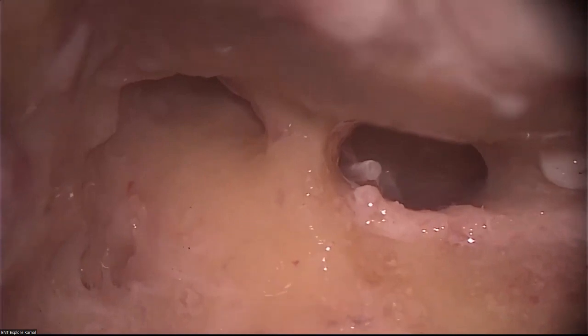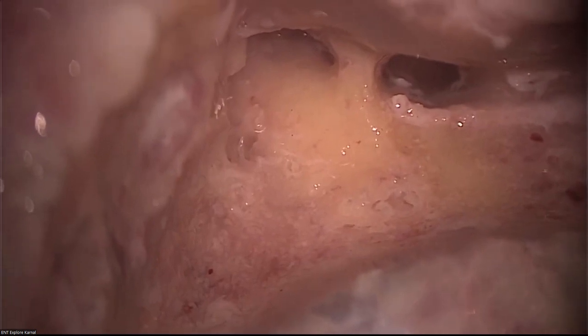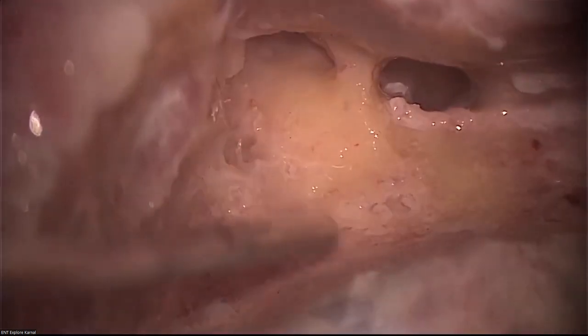Boss, how to prevent shaft injury to the facial nerve at this stage? For such times, you need to have a long, sharp, tapering burr, a long tapering burr, to protect the facial nerve from getting unnecessarily injured.